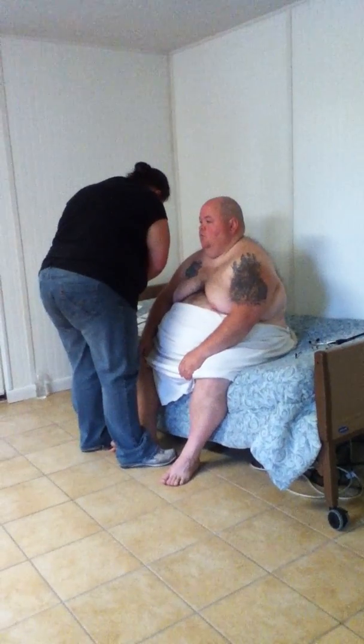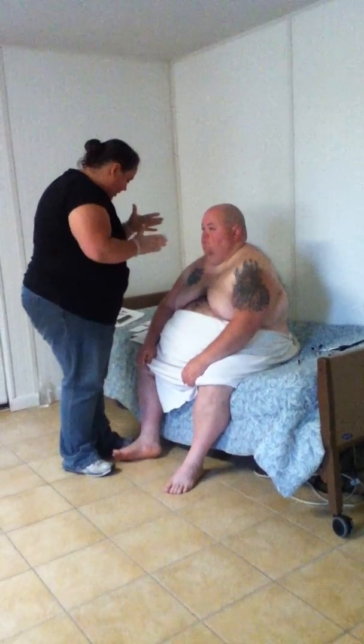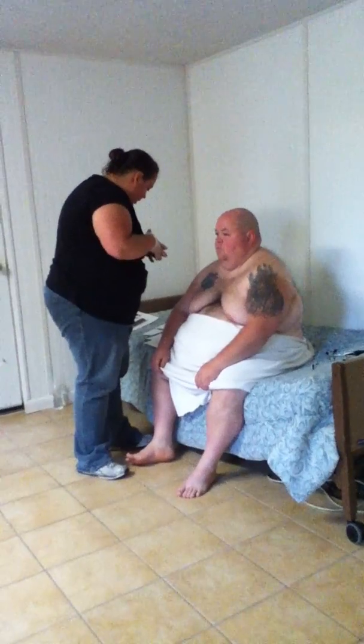Do it on both eyes. And while you're there, you're going to be looking for the retinal vessels, the color, the artery and vein ratios, the arteries and veins where they cross. There should not be any nicks or tears, any problems with that.